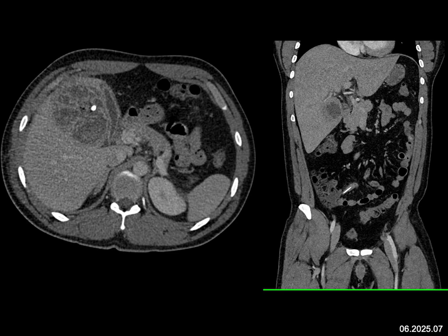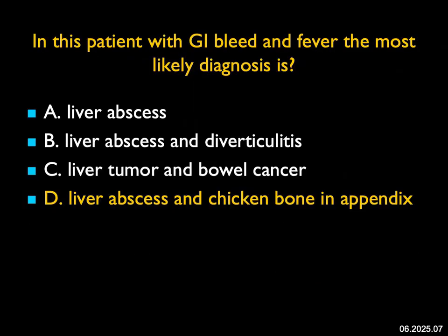I don't think this is a liver tumor and bowel cancer. Rather, this is a liver abscess, and that linear calcification or high-density structure is actually a chicken bone. The patient had a perforation of bowel secondary to the chicken bone and then developed an abscess. A really nice example — you've got to watch out for those chicken bones.